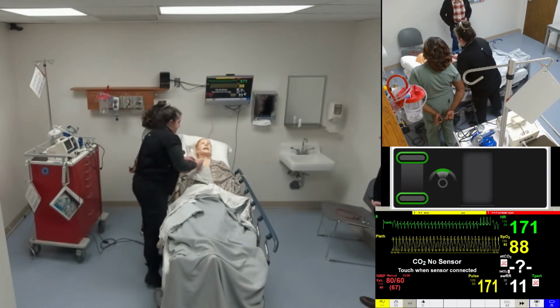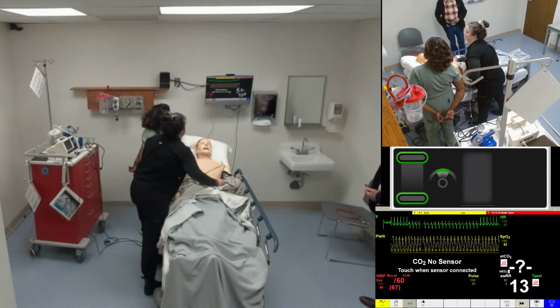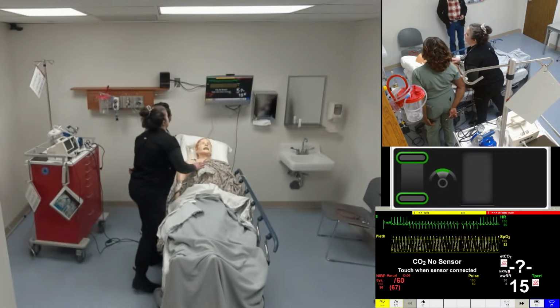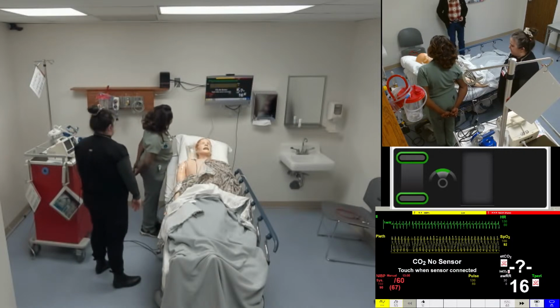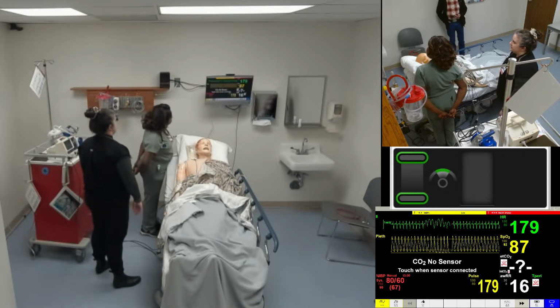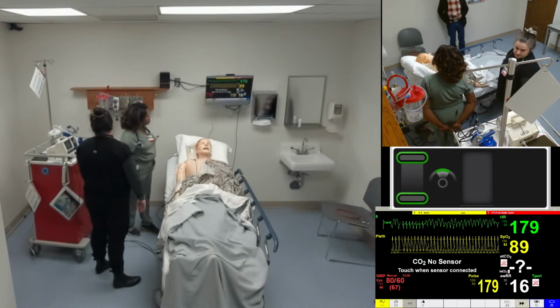The rhythm just changed. Oh, the rhythm just changed. Yeah, it's great, sinus. Sinus. Scenario complete. Push analyze. Analyzing now. Stand clear. Alright, now what do you got? Now you shocked him. Analyze. Okay, great.